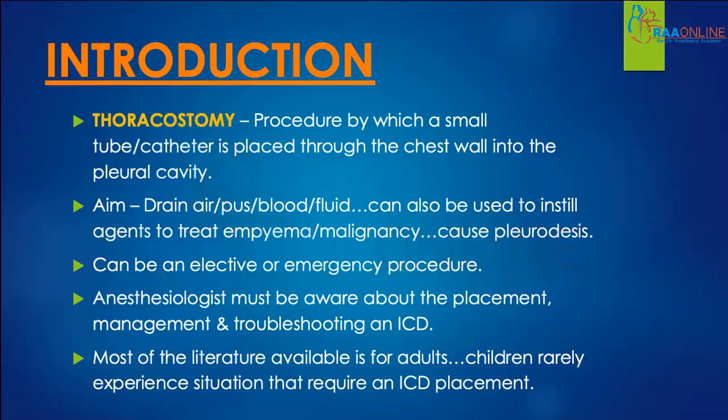So he or she must be aware about the problems with an ICD and how to troubleshoot the complications. So most of the literature that is available for an ICD is only for adults. That's because probably children rarely experience situations that require an ICD placement, except probably in the OR.